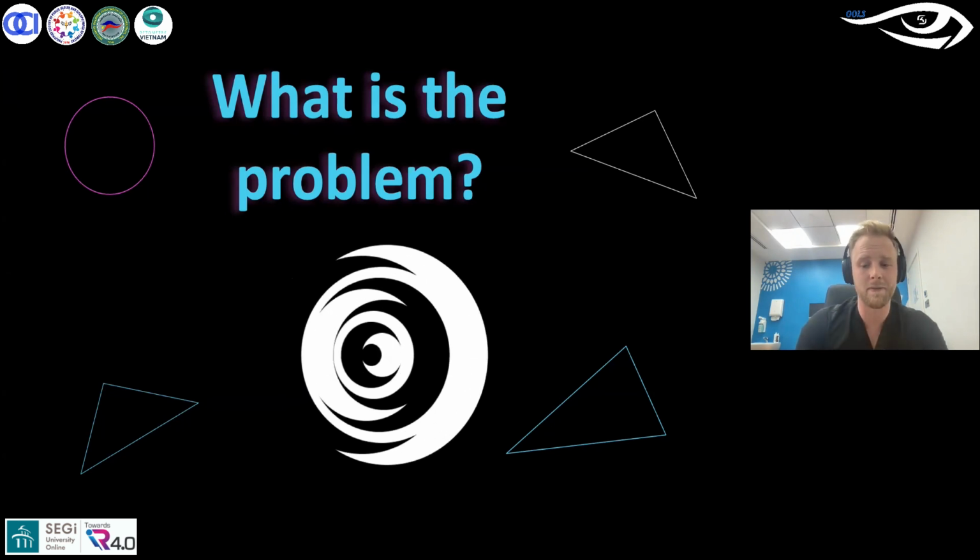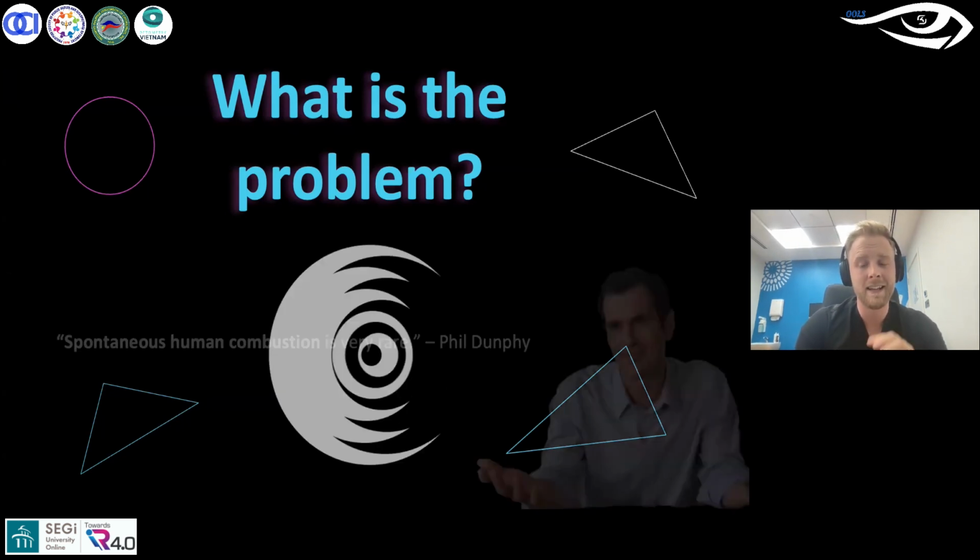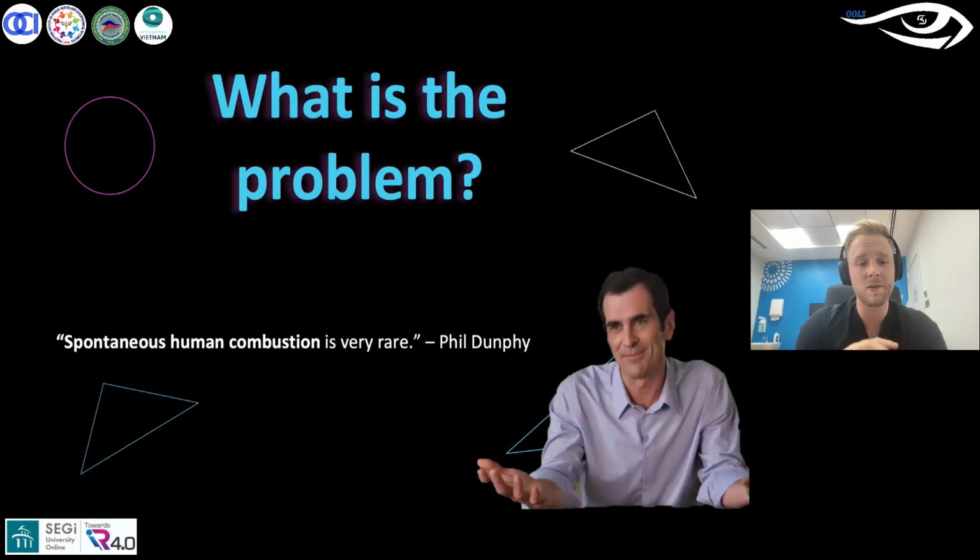And you need to be brave when you're refracting these patients as well, okay? The endpoint's not always clear, but that's okay. We're here to improve our patient's vision, okay? So I quite like this Phil Dunphy quote, spontaneous human combustion is very rare. We're here to try our best to help these patients, okay? So don't panic, okay? Some lubricating drops to start with.